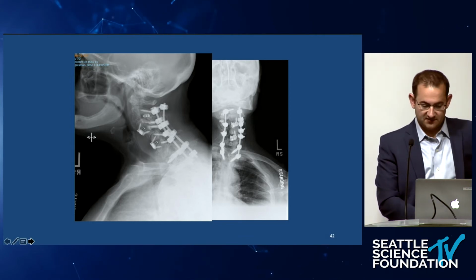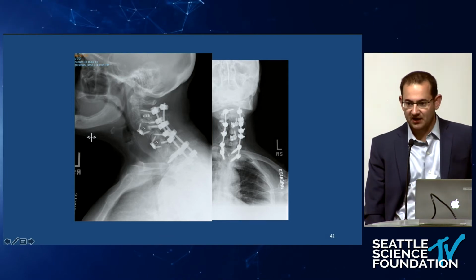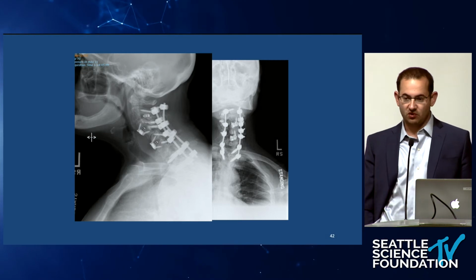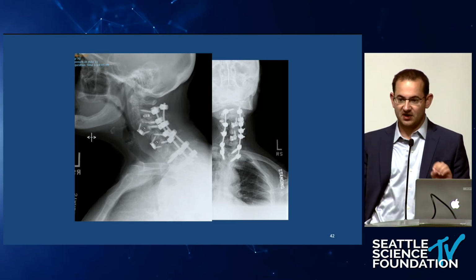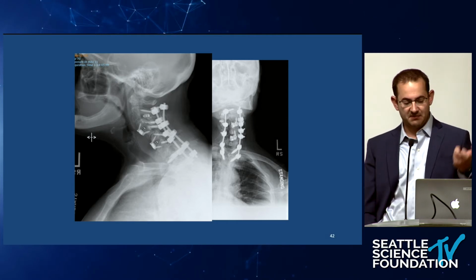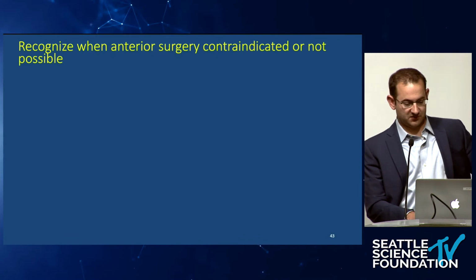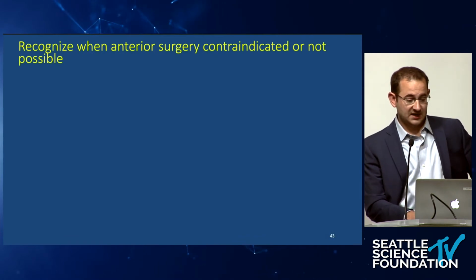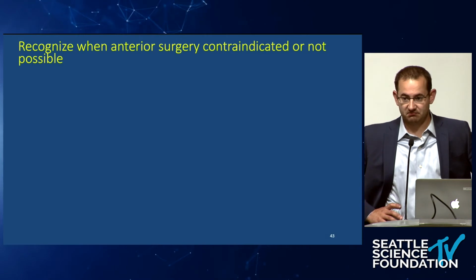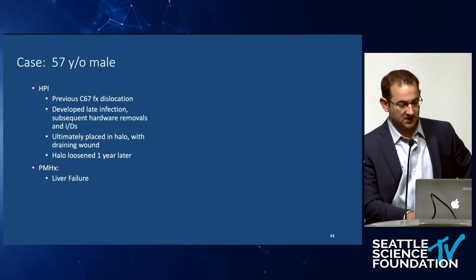I always made fun of these little shims, but I finally ended up taking a lot out and fused over them. But when I distracted her in the coronal plane, she had huge holes in her facets, and I tried putting bone graft in there, but they had these things, and I filled them with DBM and put them in the facets, just thinking it might give her a little bit more support. And so she's done reasonably well, and I ended up taking off the halo because she just couldn't tolerate it almost immediately post-op, and she hasn't collapsed, and it's been 6 months.